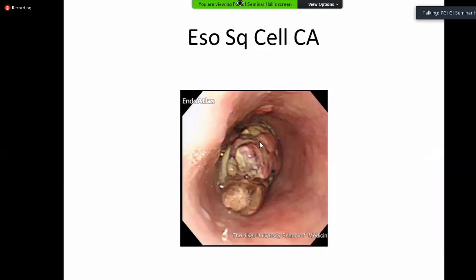So this you will describe as a polypoidal lesion, depending upon the site of upper third, middle third, lower third, so many centimeters from incisors or so many centimeters above. Obviously, you will not go across the growth here. So polypoidal, friable, with patches of ulceration, not negotiable, lower limit not clear, cannot be ascertained. So that will complete the examination, and obviously it will warrant a CT scan to know the extent of the lesion.